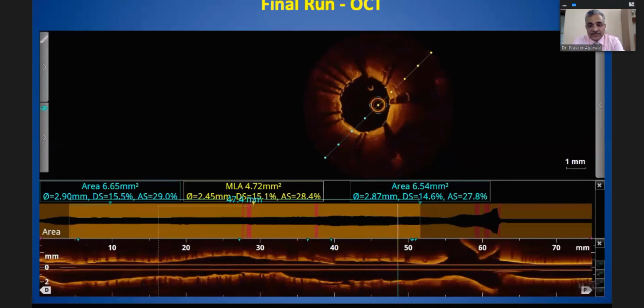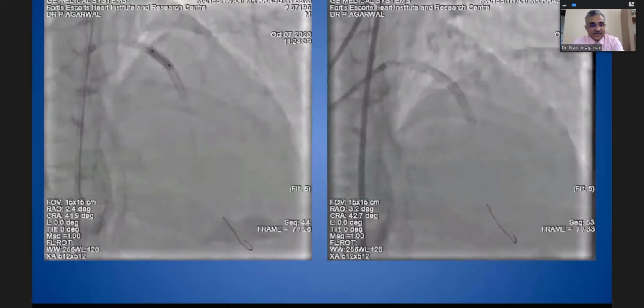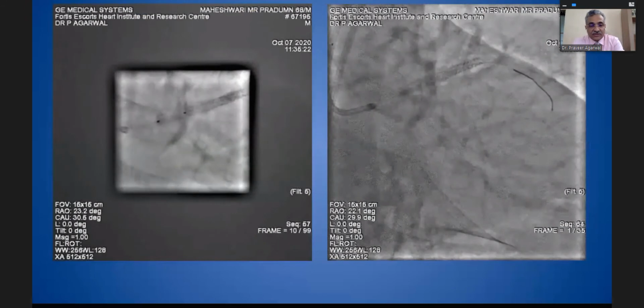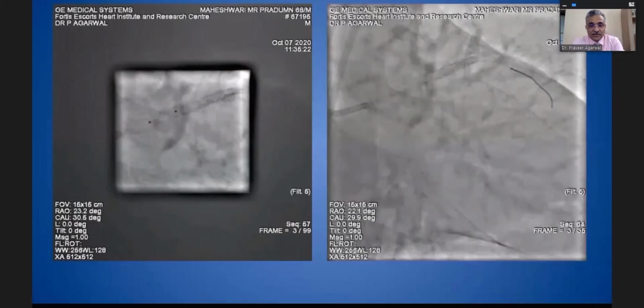So after this OCT run, we took a 0.25 oversized balloon and did it at nominal pressures, maybe slightly higher pressures, and got a reasonable result in this kind of bad lesion. We know that all these lesions with restenosis come back very, very soon if you don't do a good job at the second setting when you get a chance.